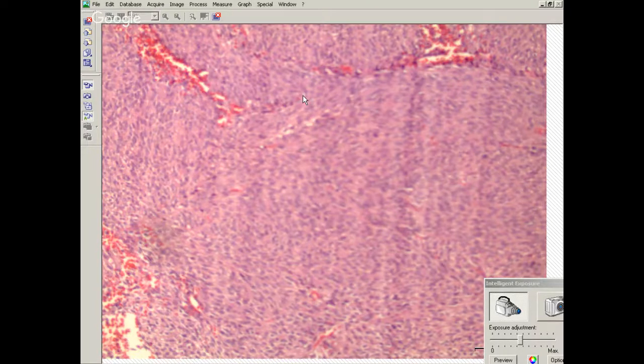This one was relatively apigmented. When I distributed this to our regional neuropathology group, one of the neuropathologists said that they had cells that had pigment. But that's it. Nobody else had it. We had multiple sections from multiple resections that were completely amelanotic. So most are melanotic, but there are some that are amelanotic. It's something to just remember.